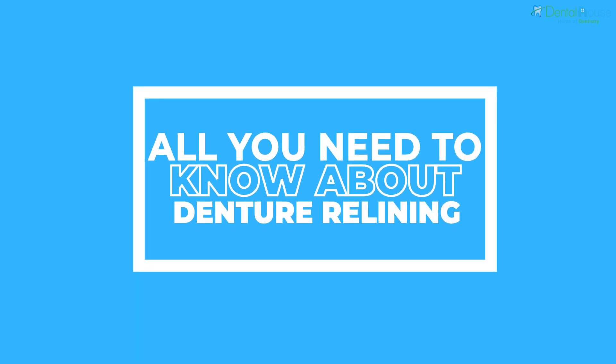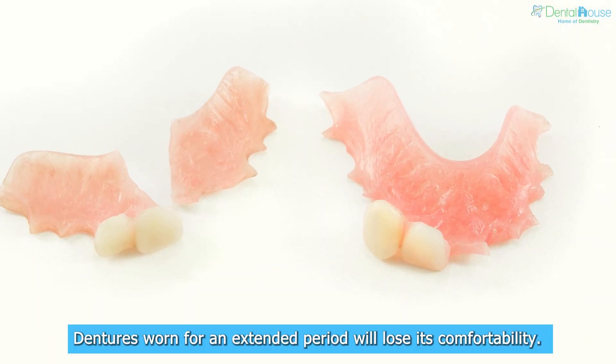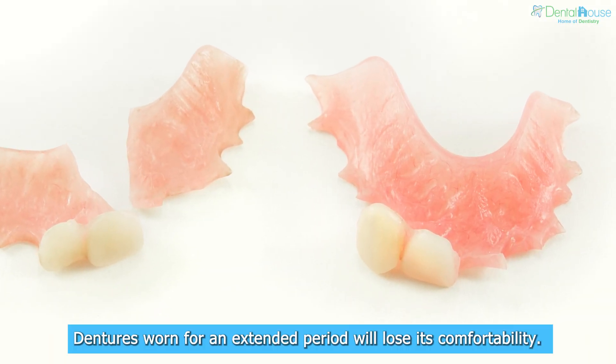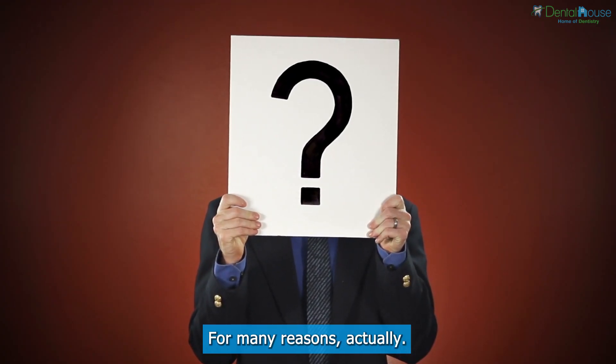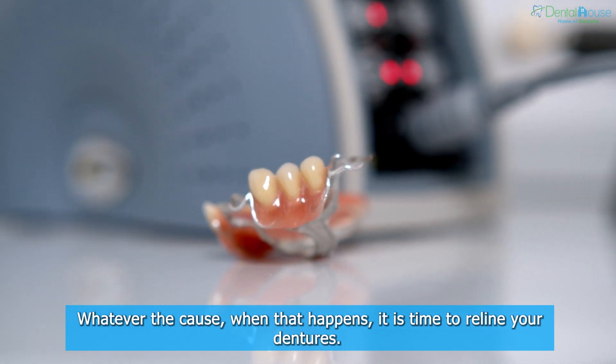All you need to know about denture relining. Dentures worn for an extended period will lose their comfortability. This happens for many reasons, and when it does, it is time to reline your dentures.